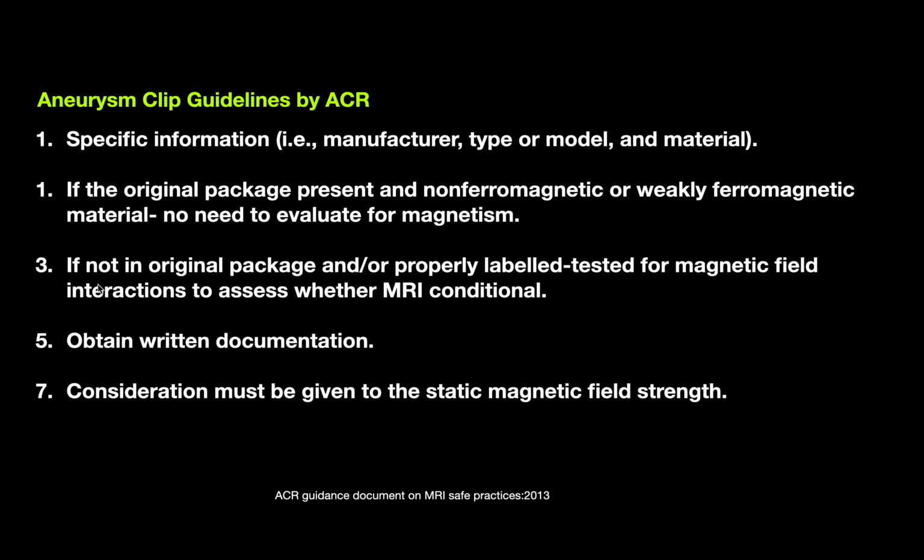If not in the original package and not properly labeled, it should be tested for magnetic field interactions to assess whether it is MRI conditional or not. Obtain written documentation when we are scanning such patients, and consideration must be given to the static magnetic field strength. So these are the aneurysmal clip guidelines by ACR.